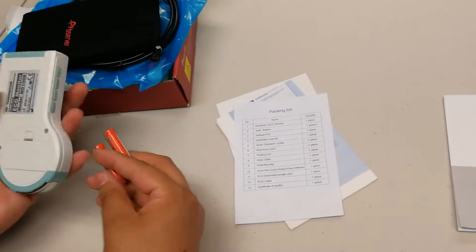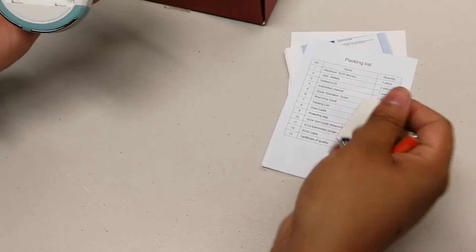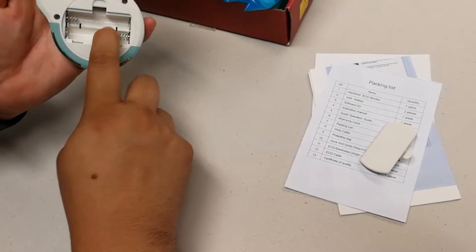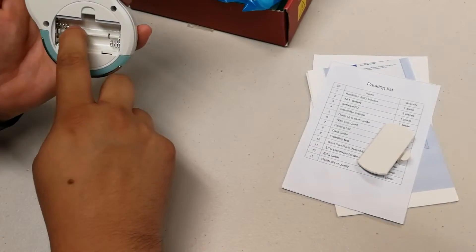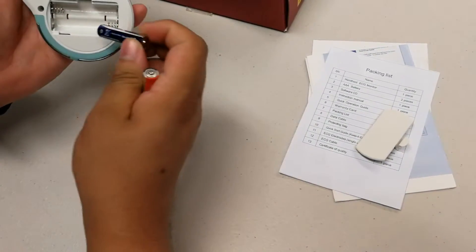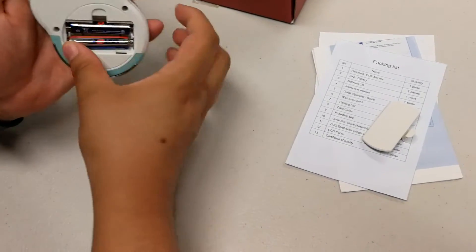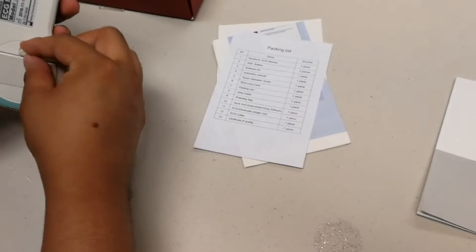To load batteries into the unit, first remove the battery cover case and look inside the cover — you will see a plus and a minus sign. Please place batteries as directed by the indents inside, and then close the battery cover back up.